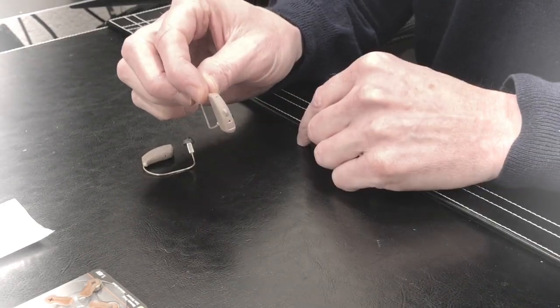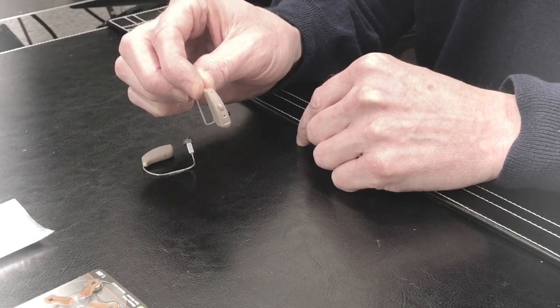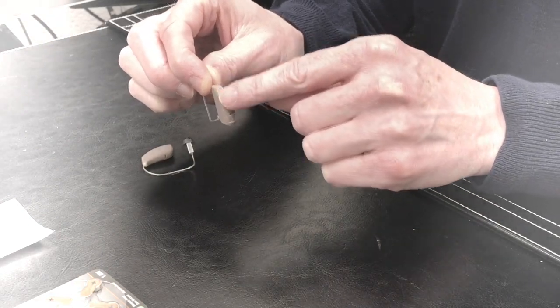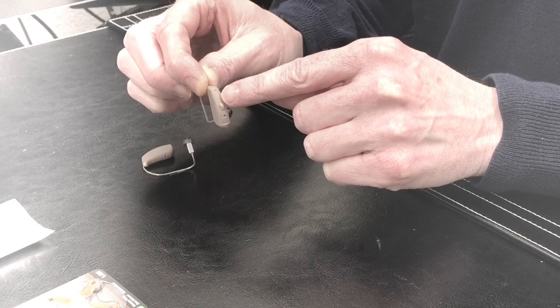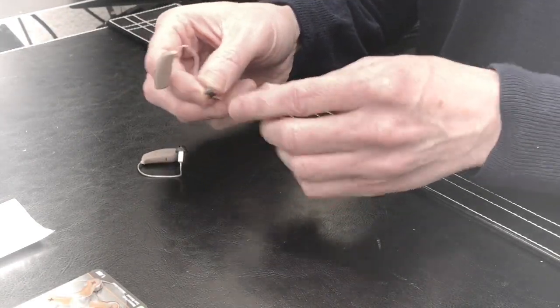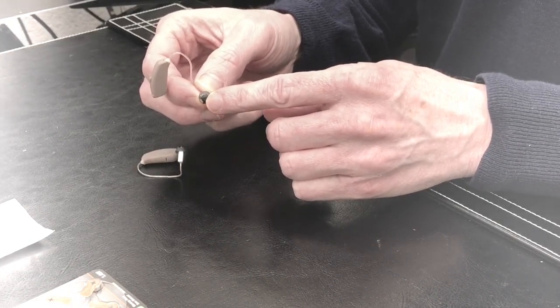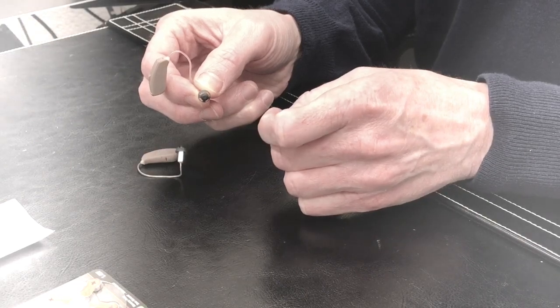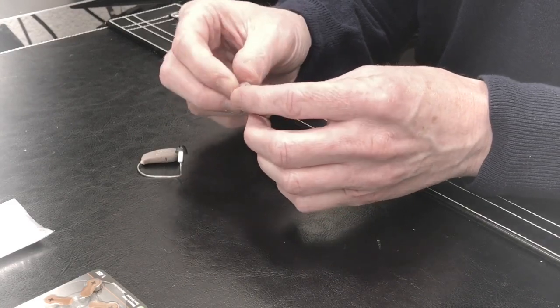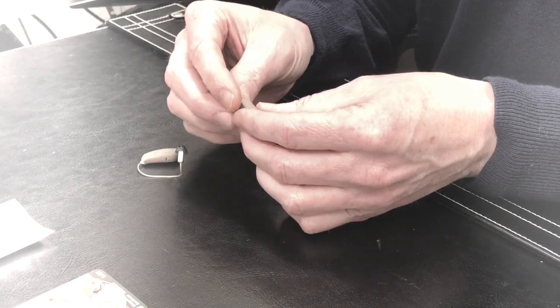The only spots you really have to pay daily attention to are the microphones, which are on the back of the actual hearing aid. That's where sound's coming in. And the speaker, or sometimes called receiver, where the sound is coming out of the hearing aid. Assuming those two areas are clean and the hearing aid is properly functioning and it's got a good battery, you should be fine.